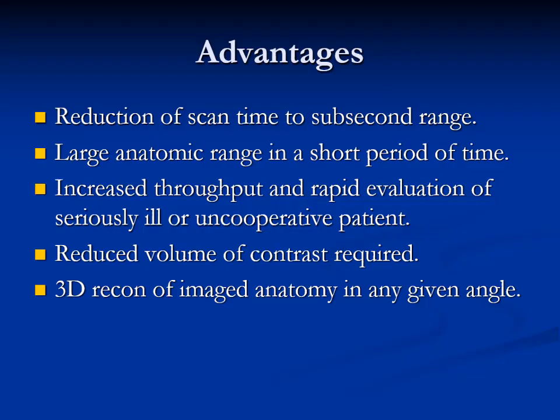Advantages. Reduction of scan time to the subsecond range. Large anatomic range in a short period of time. Increased throughput and rapid evaluation of seriously ill or uncooperative patients. Reduced volume of contrast required. 3D reconstruction of imaged anatomy in any given angle.